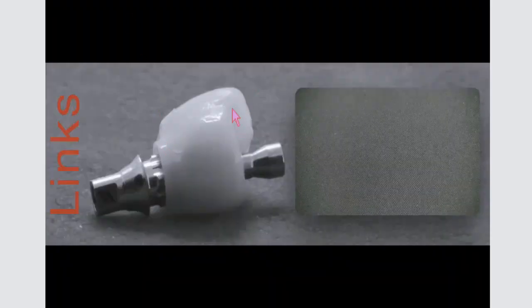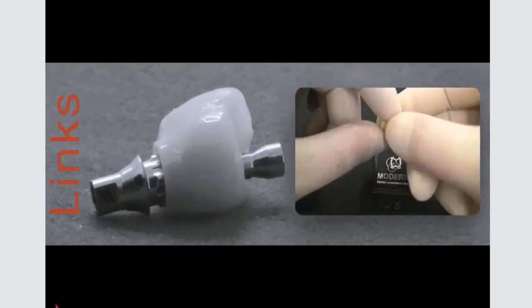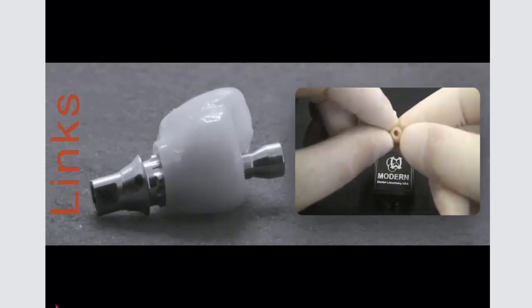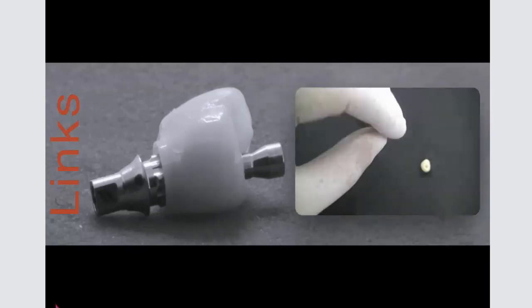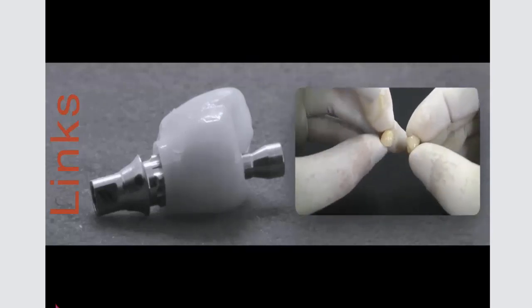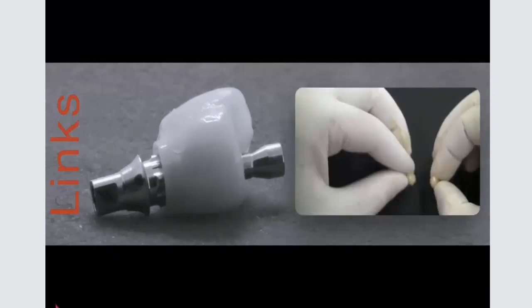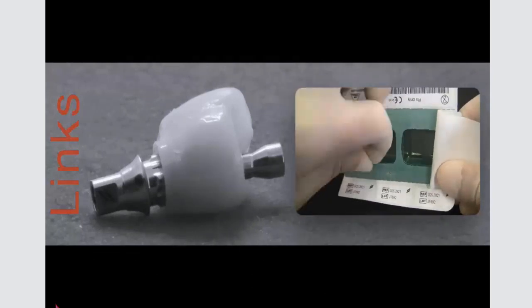And the cementation, when the crown is made and is finished, here you can have a little hint on the cementation. I sent the crown to be fabricated in 2 different laboratories. One was in the US, the other one was in Brazil, just to see if I would have any discrepancy on sending files from different places and how they work. And of course, the STL was a single STL that I sent for both companies.